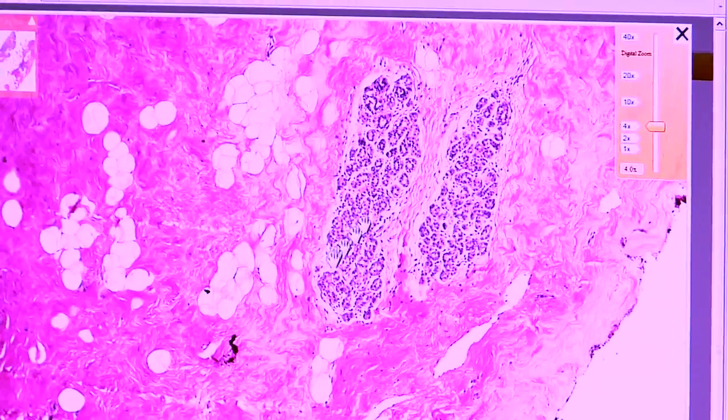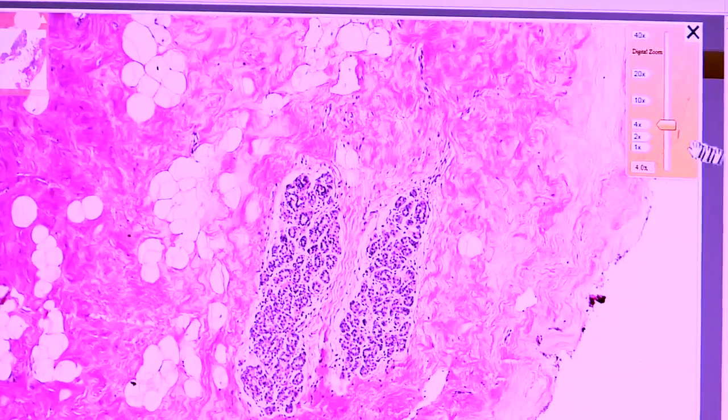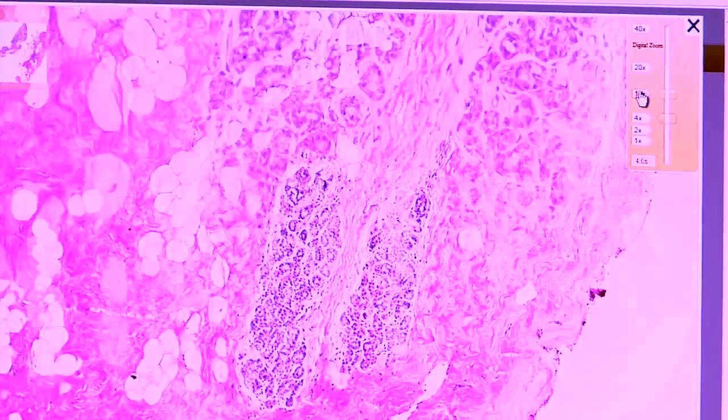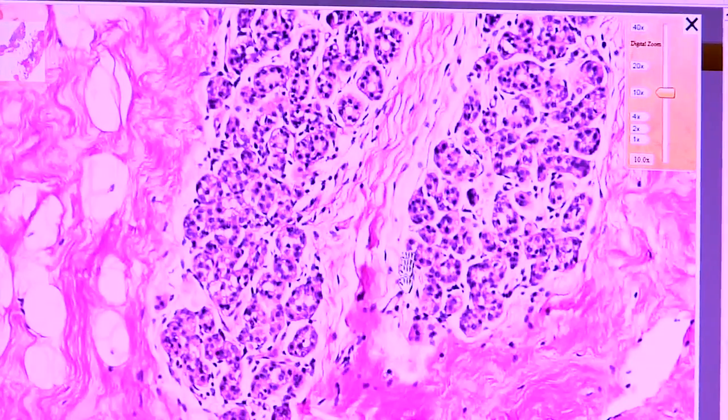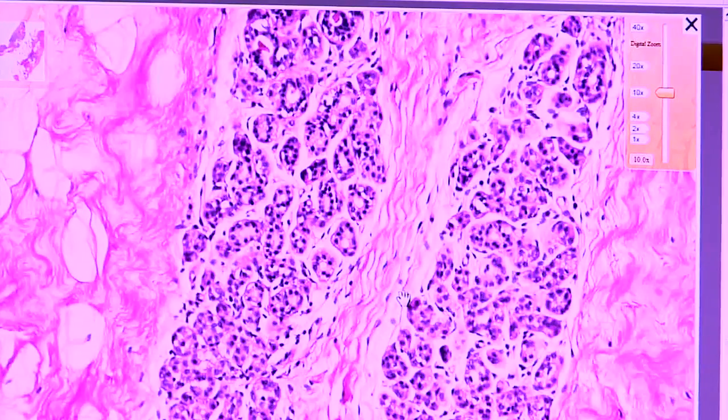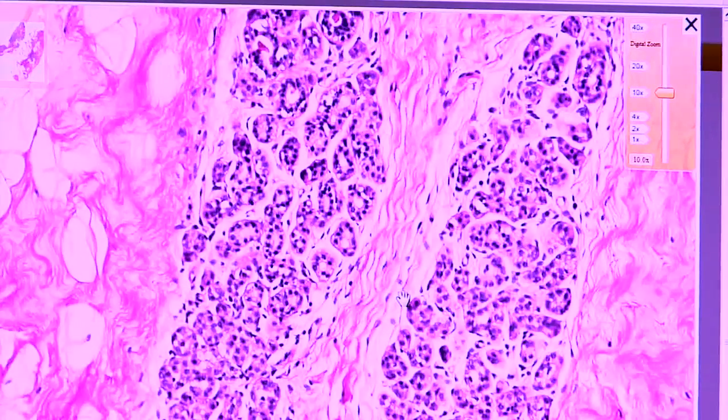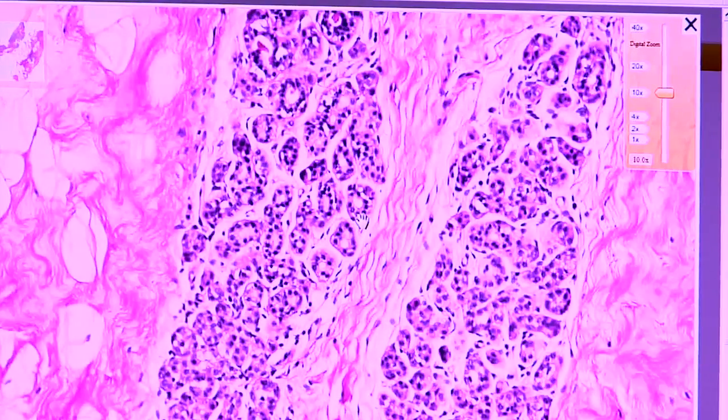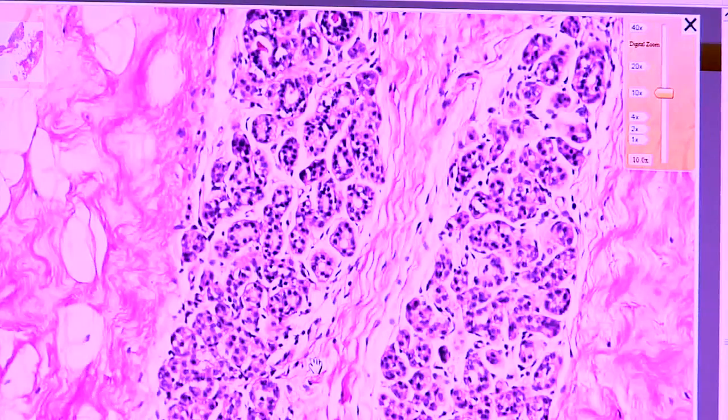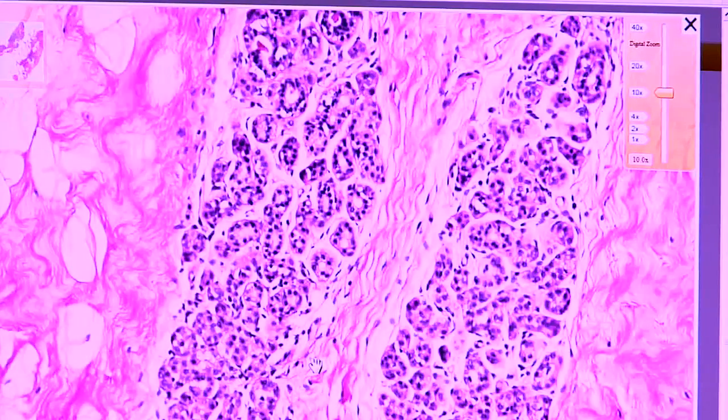When we look at this area, we can even go higher to 10X. We see, in fact, they are normal acini. They are aligned by two cell layers, a myoepithelial and an epithelial layer. They are well circumscribed and they resemble normal lobules of the breast.